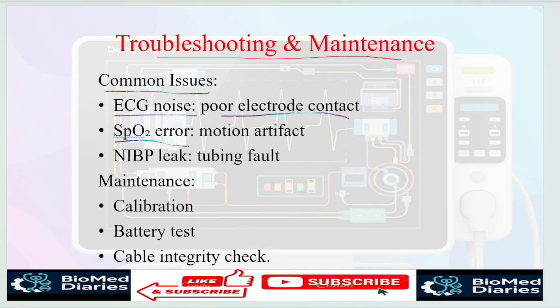For SpO2 error, motion artifacts may be another cause, or it may be a disconnection. Such as NIBP leak: tubing fault, the tube might leak, or there are some external factors like puncturing of the rubber cuff, which causes an NIBP leak.